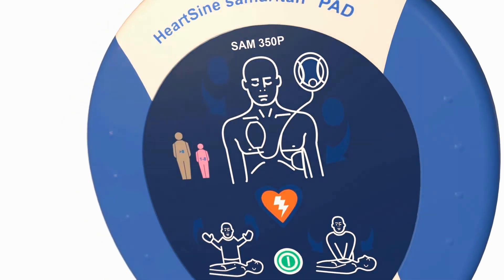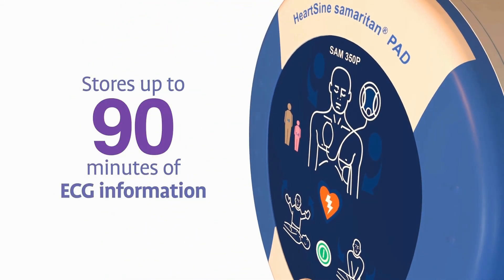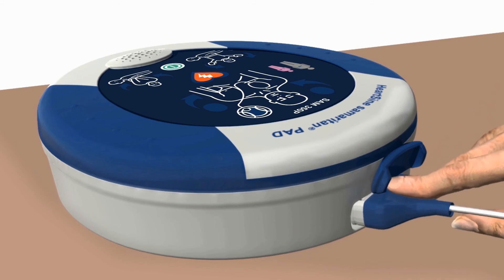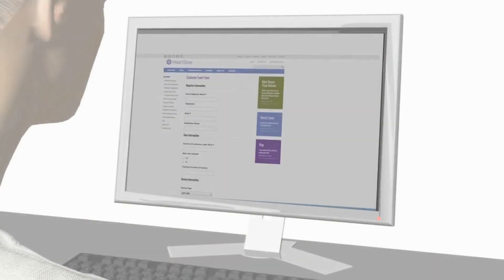The Samaritan PAD stores up to 90 minutes of ECG information after use. Use the Saver EVO software, which can be downloaded from the HeartSign website, and the custom USB data cable to download the event data for a physician who may want the information from the device to help inform treatment decisions.